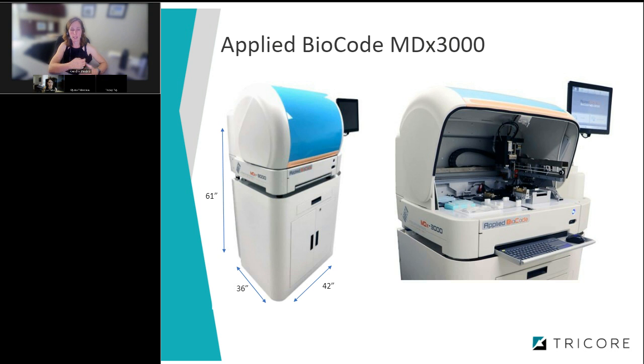And that's when it's tested invalid the first time. So when it tests invalid on the first run, our assumption is that the initial loading of that tube, the star buffer tube that contains the beads and homogenizes the stool, that initial inoculation was just too much. And if anyone's worked with stool, too much is a big problem in terms of PCR inhibition.